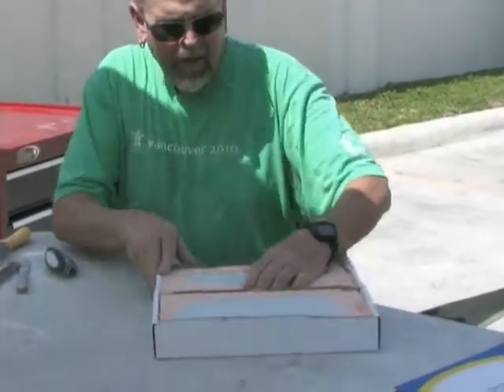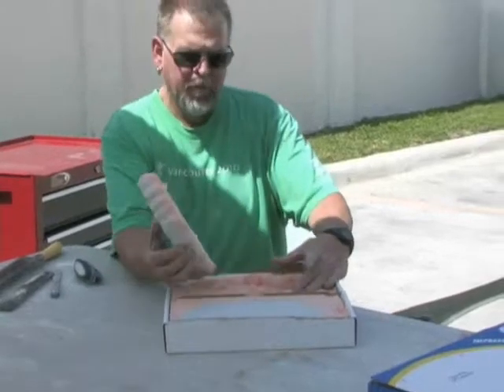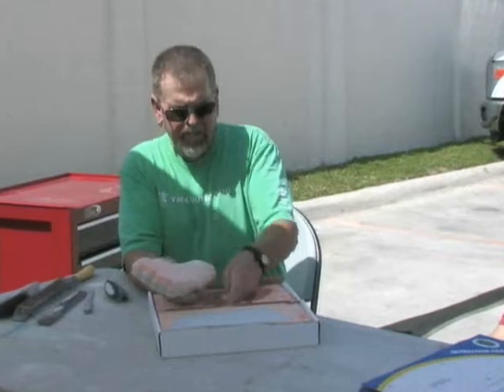We're in good shape. You have to be very delicate with this — just pull that out. Everything is good with this, it's nice and hard, it's not going to change anywhere.